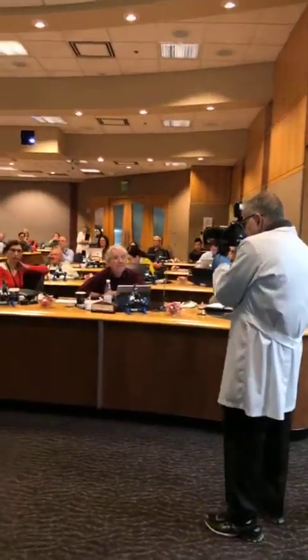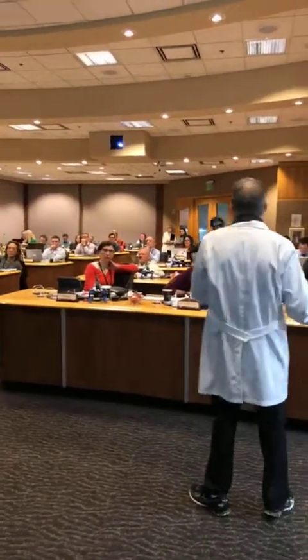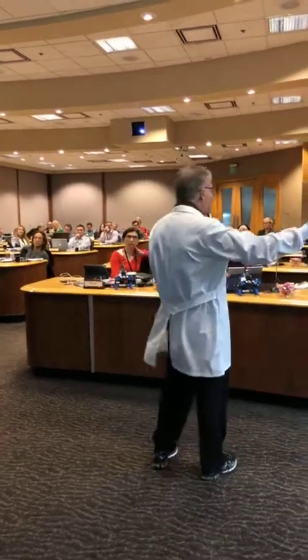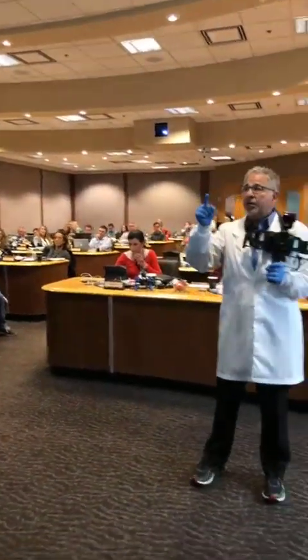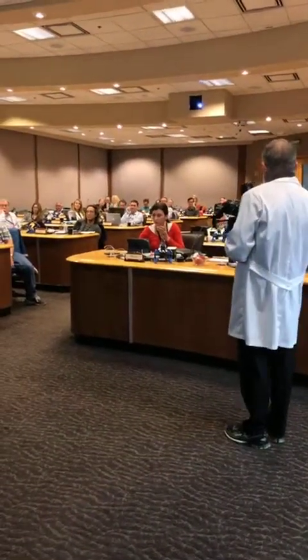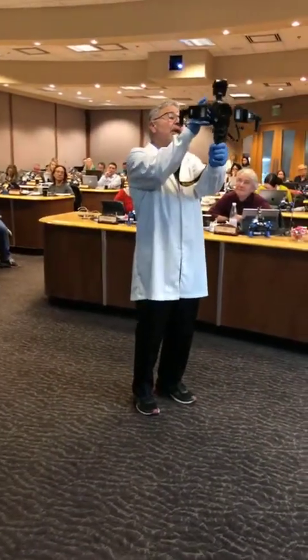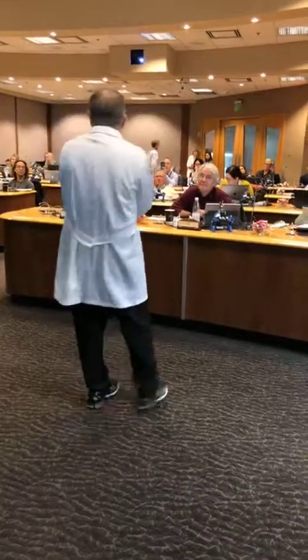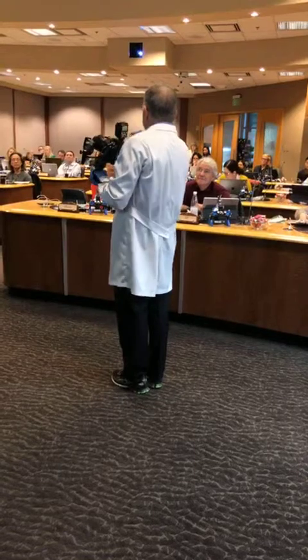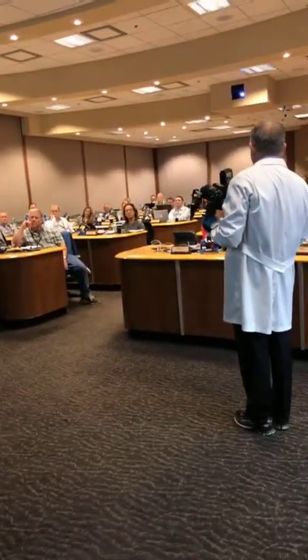I did not take the camera off my face. I kept the camera on my face and my body locked — keep your elbows in. Dentists ask if they should use a tripod, but a tripod makes no difference if the person's moving. Just move it back and forth. You can see her head is very much in the same place every single picture. When you look at the back of the camera, if you did well you'll see the patient barely moved. Remember: repose, Duchenne, lip dynamics.